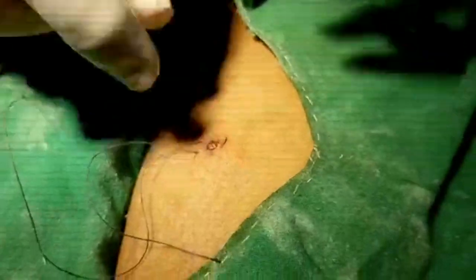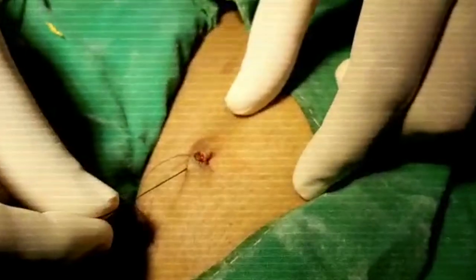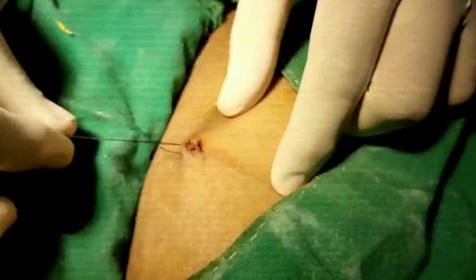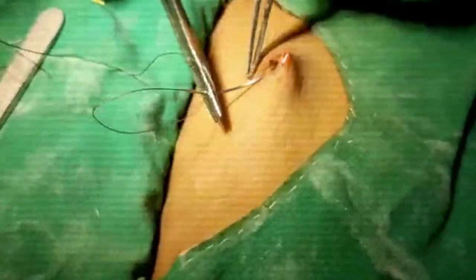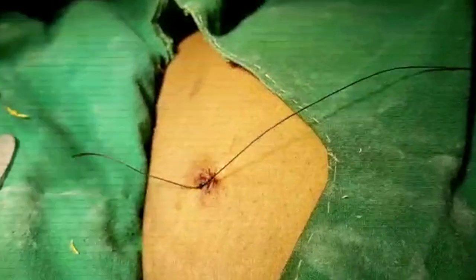This is the excised mass and there is residual skin. No need to suture the skin since this is a very small wound, or you can give one single stitch — a purse-string suture is not required. I am removing the suture. It is better to give a mattress suture, as that will be easier for removing the stitch. This is a very small wound.